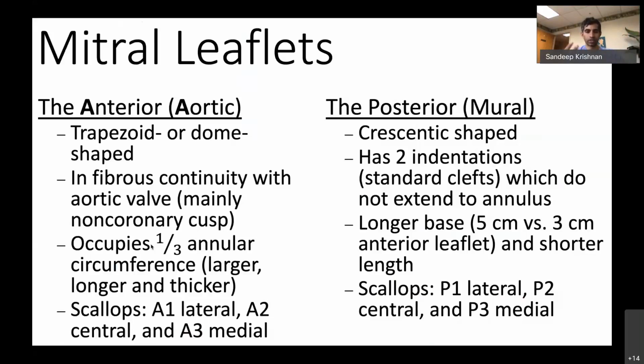And the way I just remember that is A3 is like this, 3 is like this, and then if you flip it over, it becomes an M. Stupid pet tricks, I'm full of them. And same thing with 1, it looks like an L almost, 1 lateral, get it? So that's how you can keep those things straight in your head.